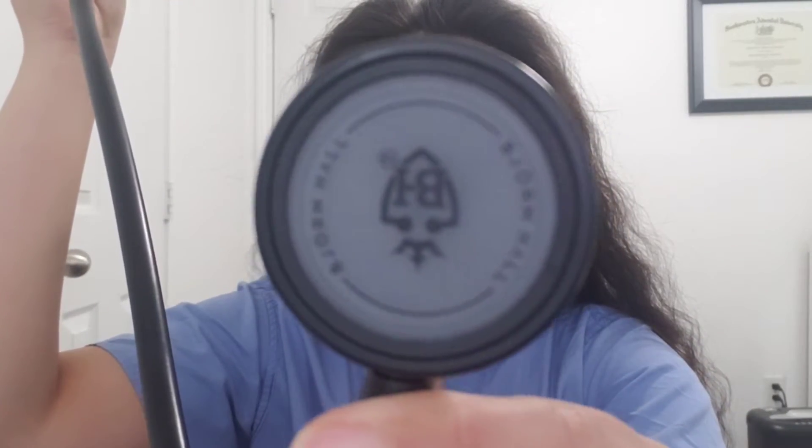It doesn't want to focus, but this is just what it looks like — it's all sleek, all black. I've always wanted a stethoscope like this that's just all black. As you guys know I have my red Littmann that has the gray earpiece. I'm going to see the comfort of it and how well it fits.